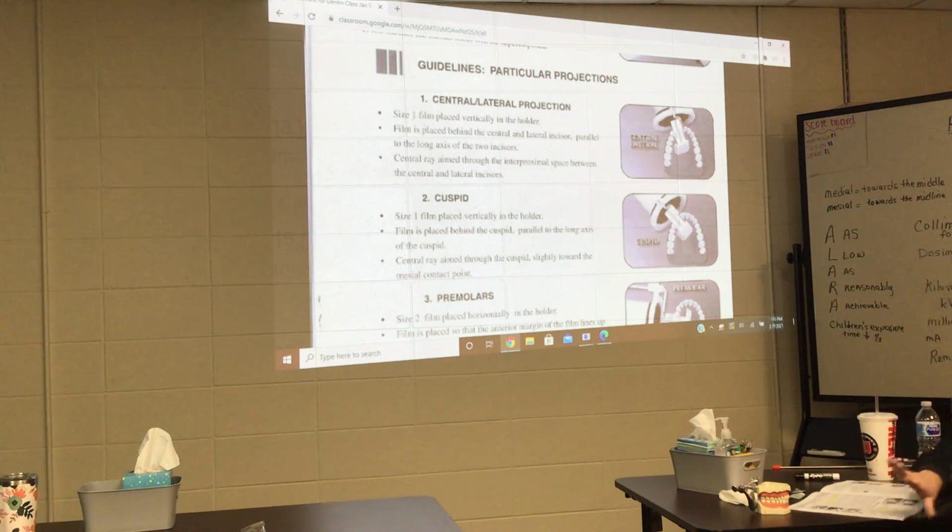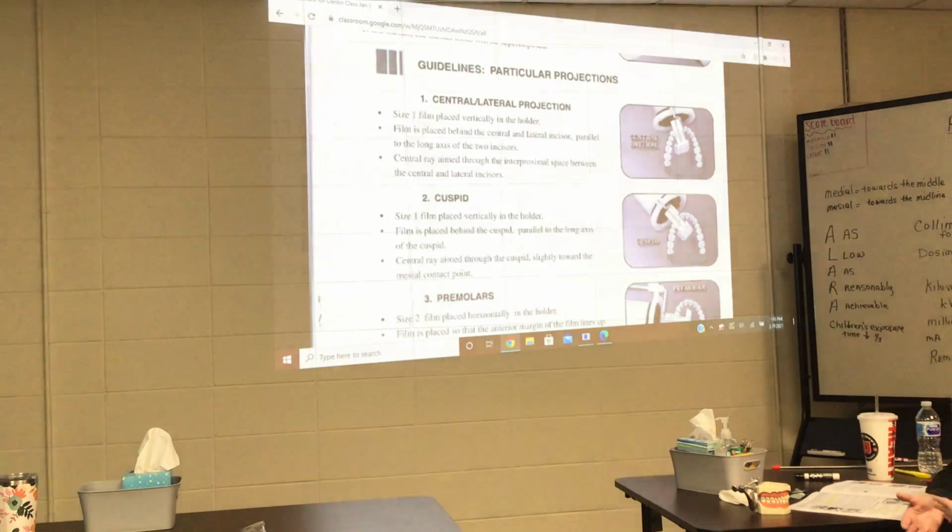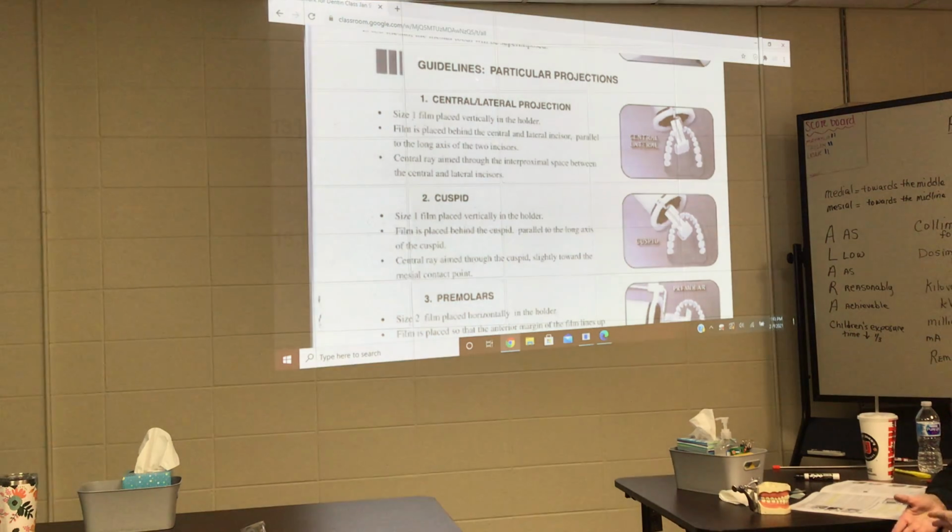But if you're relaxed and calm, and that gag reflex is temporarily paralyzed by the water because it's just done its thing and it's kind of rebooting, if you will, you can be in there and take that x-ray before the gag reflex comes again. Sometimes I have them take another sip between each film. It just depends on their level of confidence in me and my level in how fast I can do it.